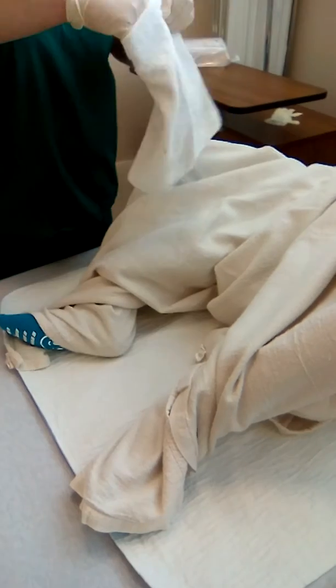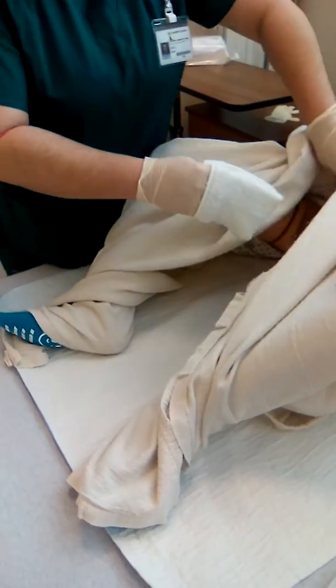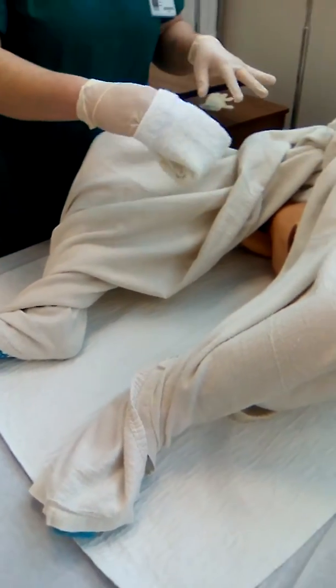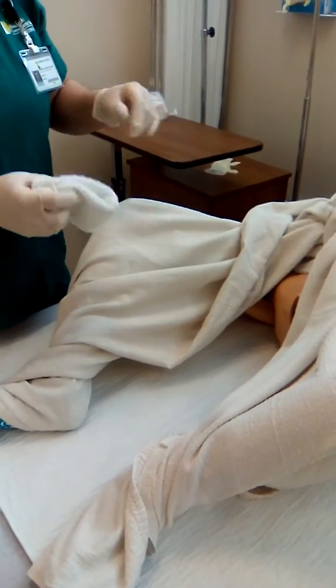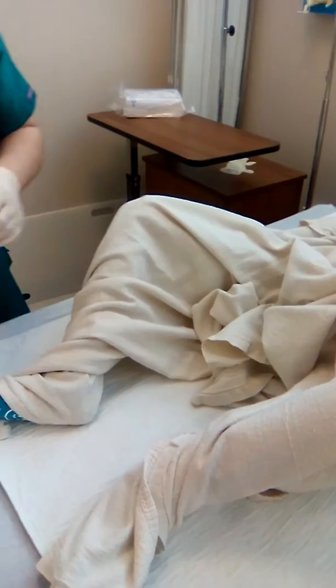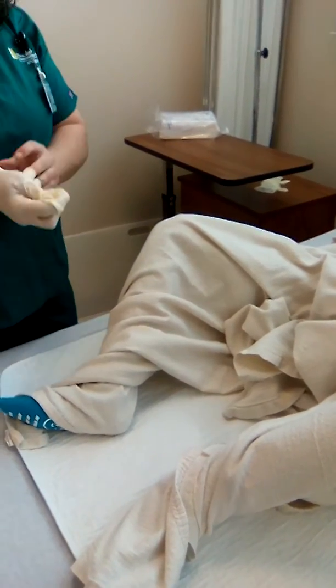Then I will provide pericare by washing, drying, and rinsing the urinary meatus. And as I did that, that's when I would notice all my landmarks. Then I would perform hand hygiene.